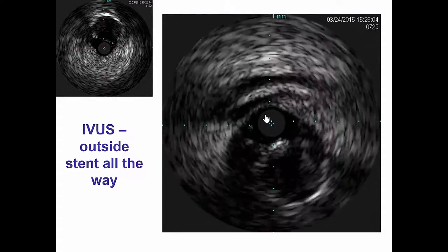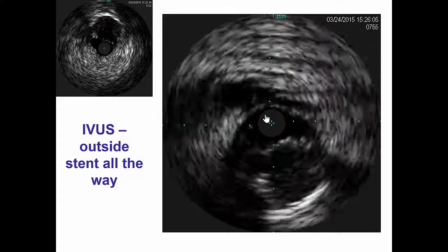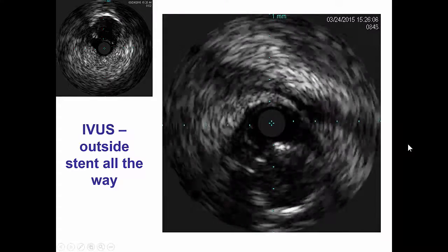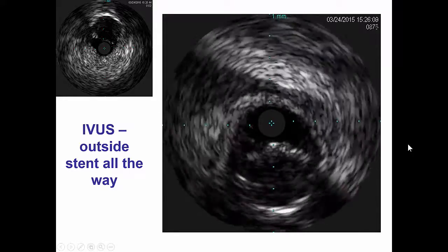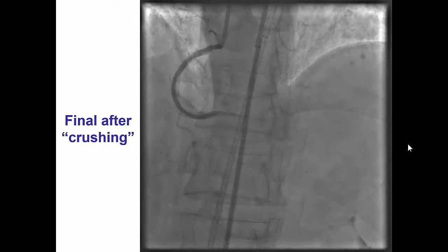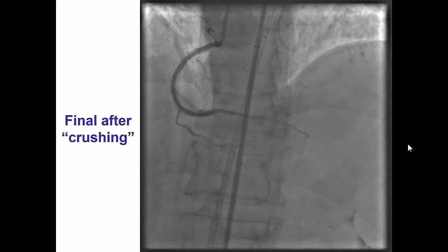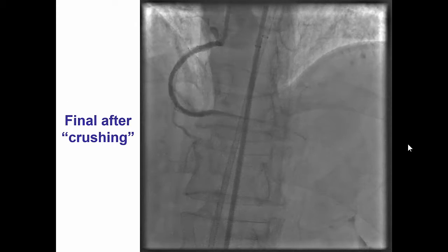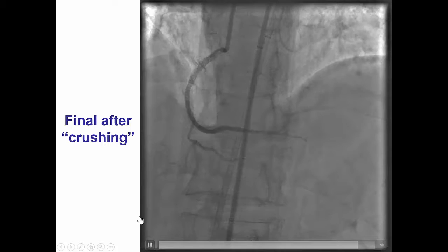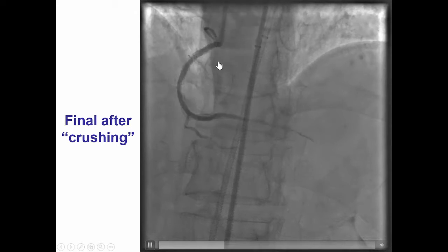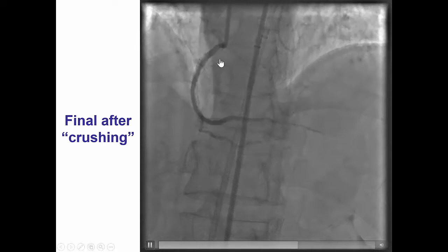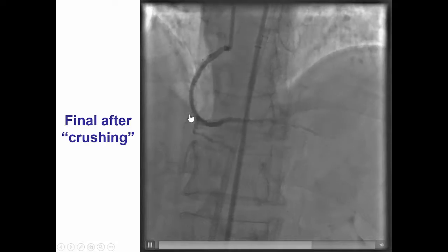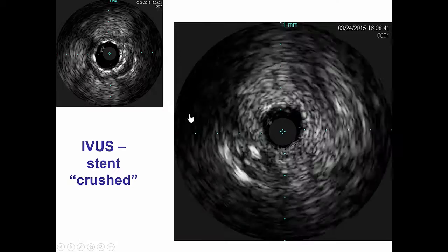There are, however, some reports showing that lesions like this can be stented with favorable mid-term outcomes, and as a result we placed stents — essentially crushing the previous stent — all the way from the PDA to the ostium of the right coronary artery. That did restore TIMI-3 antegrade flow into the vessel.